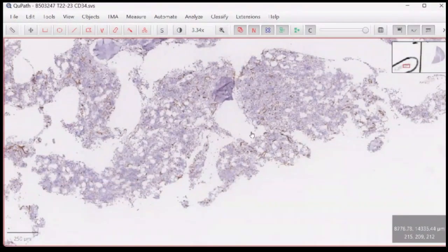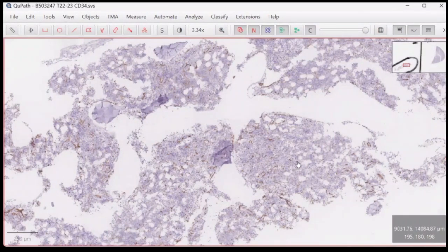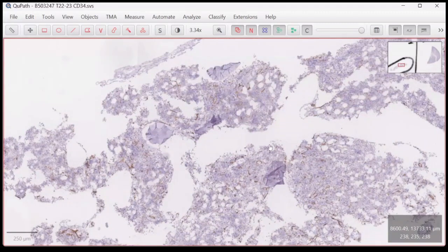But comparing CD34 and TDT, you must compare with the diagnostic and the post induction, because not all acute leukemia will be CD34 positive, so we have to compare with the pre-induction CD34. But when you semi-quantify the CD34 and TDT, you will notice under low power that CD34 is much lesser compared to the TDT just now.